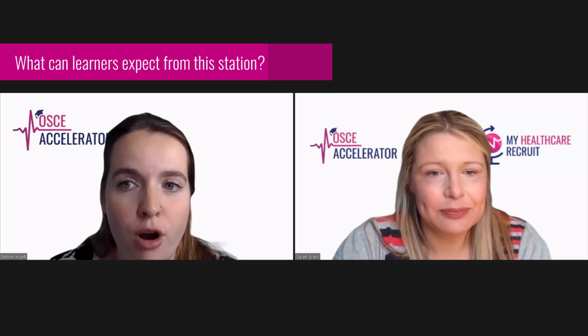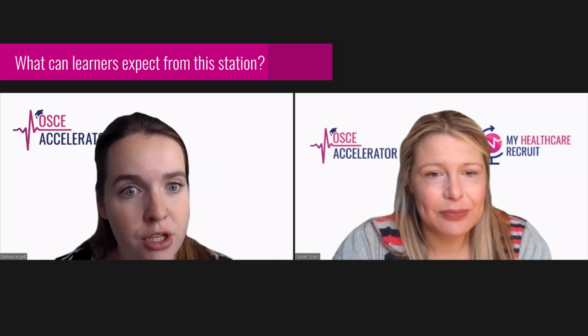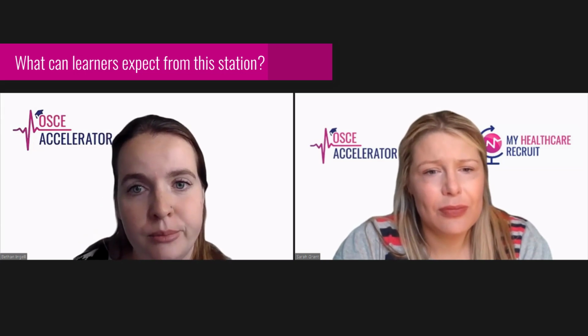Okay, so good morning everyone, welcome. For this station, obviously you're going to remove a urinary catheter from either a male or a female mannequin. The thing you have to do for the exam, which we don't normally do so much in practice, is give a lot of post-procedure advice and talk the patient through it very well.